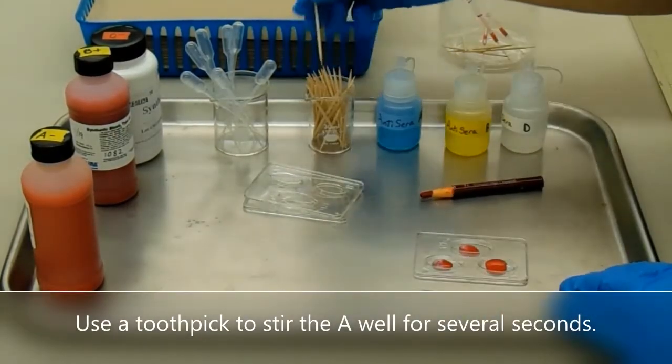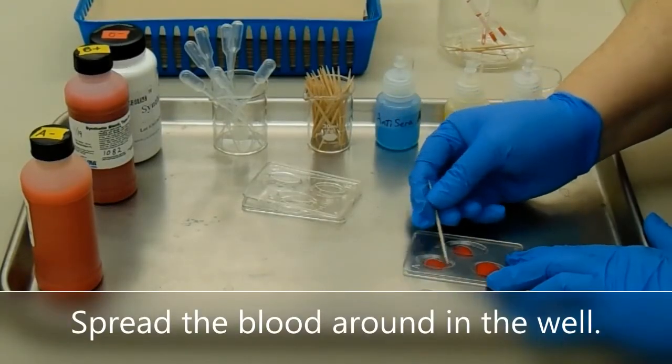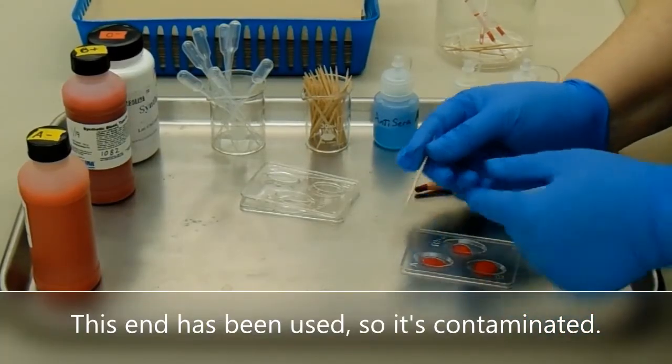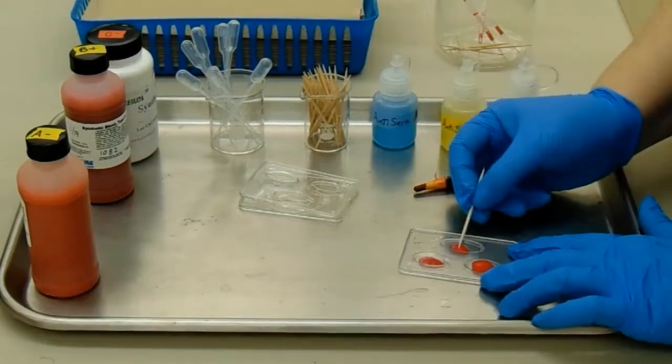Use a toothpick to stir the A well for several seconds. Spread the blood around in the well. This end has been used, so it's contaminated, but we can turn it around and use the clean end to stir another well.